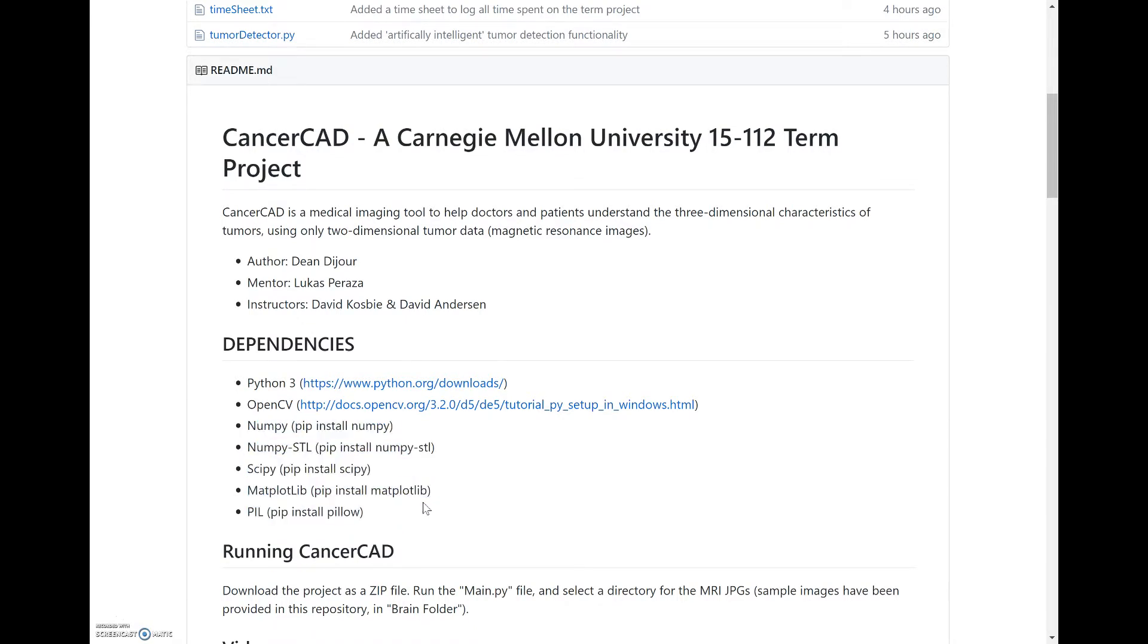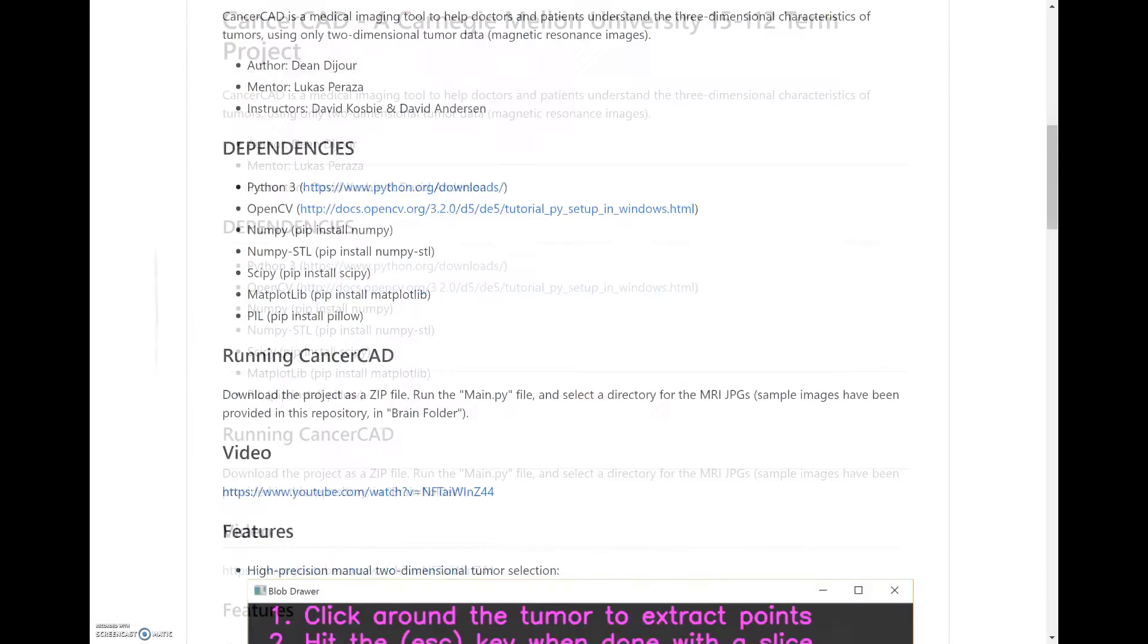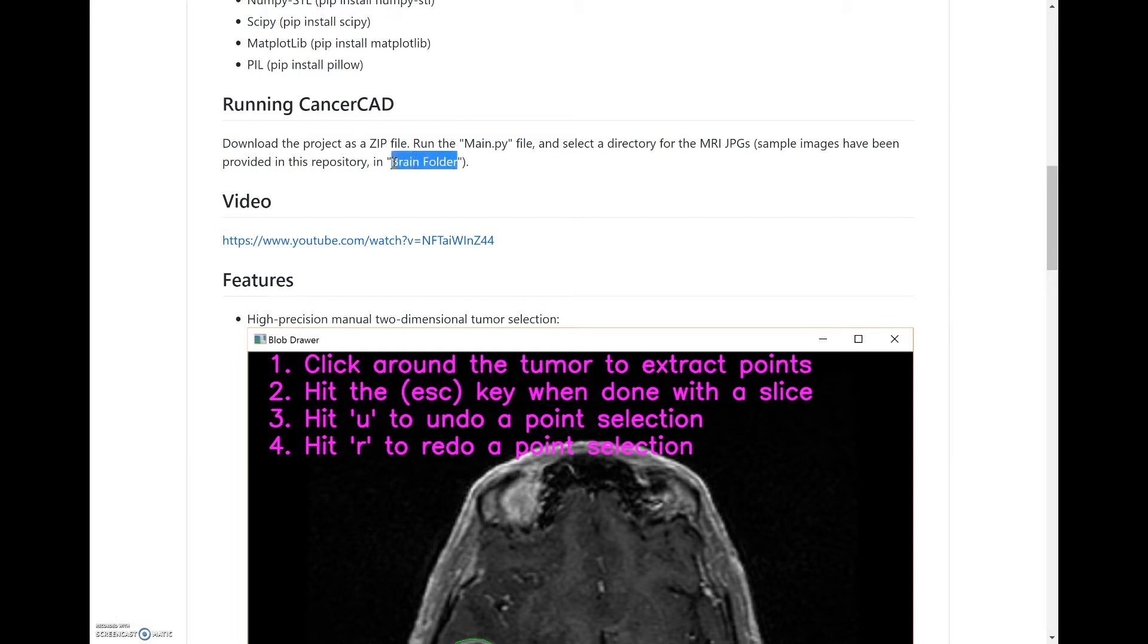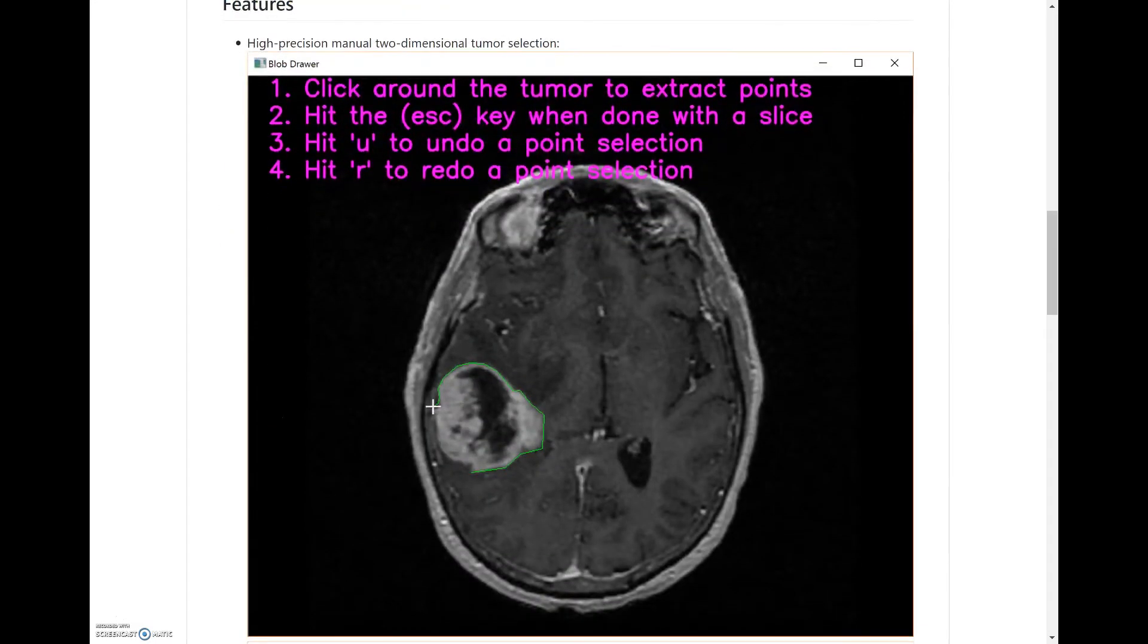If you want to run this, you can go to the GitHub and download the dependencies. Most of them are easy to install aside from OpenCV, but the instructions are listed there. The brain folder in this GitHub has all the images I'll be using throughout the video, so feel free to follow along.